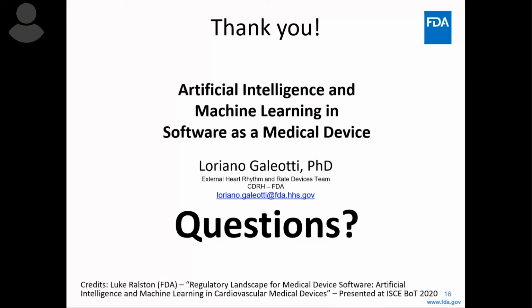I think it is more important to have good performance when you give an output, because then your patient is going to do something, either check with a physician or say, oh, I'm fine, depending on the output. So that is where we try to take into consideration the use case and what we expect. I mean, what is the use of the information and how is the capacity of the user to double check and verify the information.